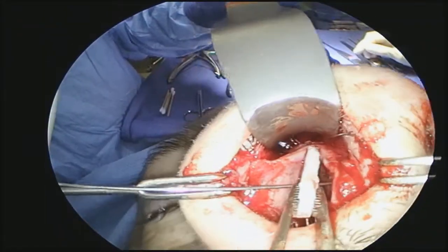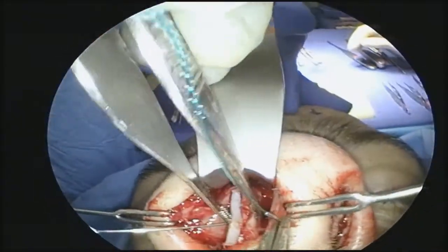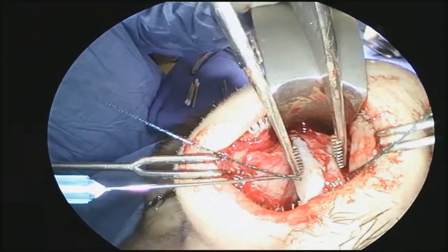The contralateral spreader graft is next secured with the barbed suture in the same fashion. The suture passes through the left spreader graft, traverses the septum, and then exits the right spreader graft.